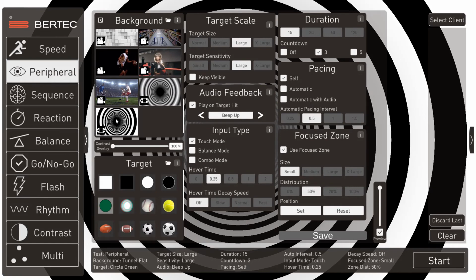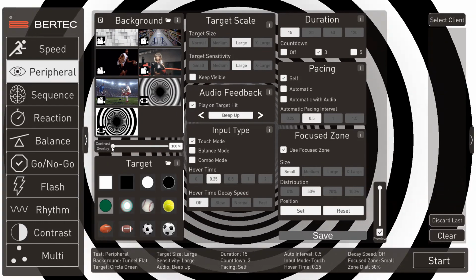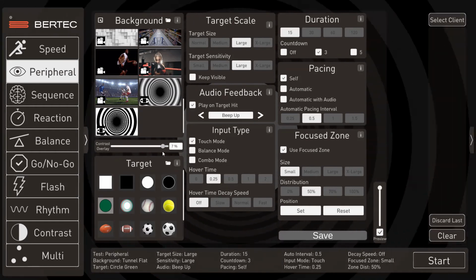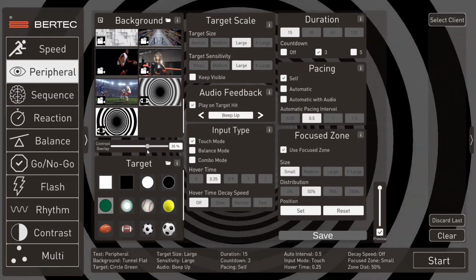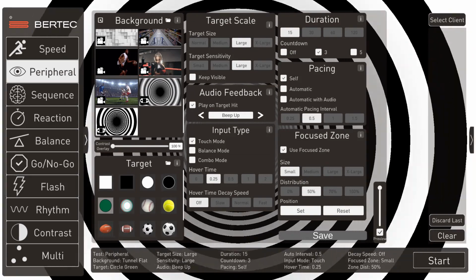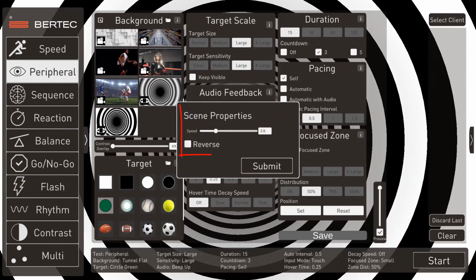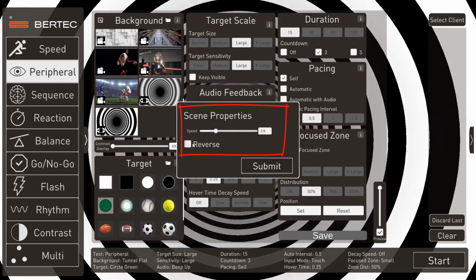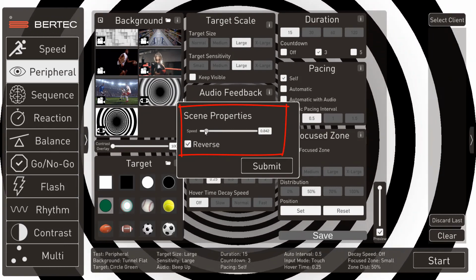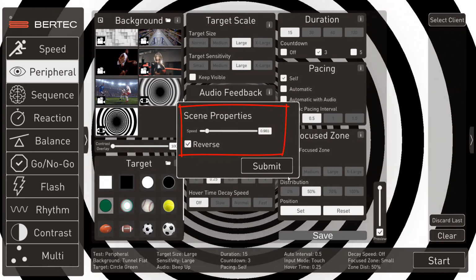Once a patient does well with the traditional OKN stripes in all directions, I suggest using the concentric circles or optic flow targets. Notice how the background changes when we change contrast sensitivity. It tends to slow things down. And there's another video on just changing contrast and how that works. But for this purpose, we're going to use high contrast targets, and we're going to slow it back down to that 0.5 to start.